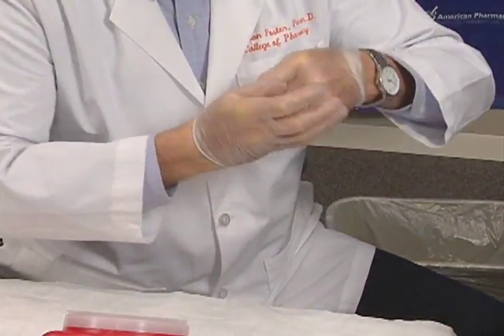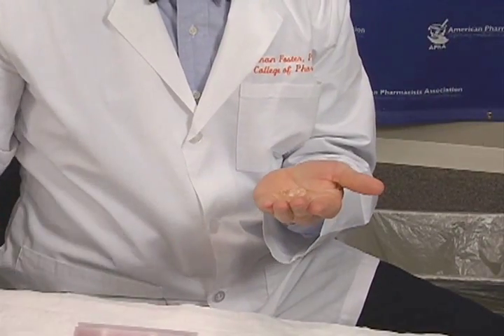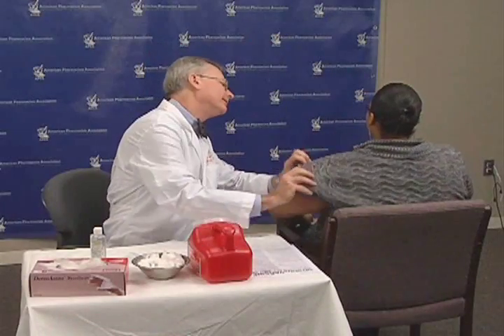Press the cotton or gauze over the injection site and secure it to the patient using the adhesive bandage. Remove your gloves and wash your hands. Clean your workspace. Provide your patient with post-injection counseling and follow-up instructions, and document the injection given while maintaining compliance with all legal requirements.